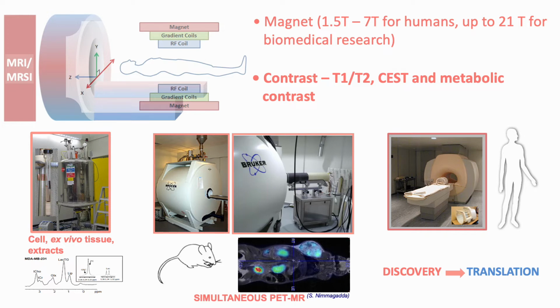So here is an example of PD-L1 imaging with PET. And you can see how beautifully the tumor shows this fairly heterogeneous distribution of PD-L1 in the tumor. The kidneys light up, and you can see some in other areas as well.